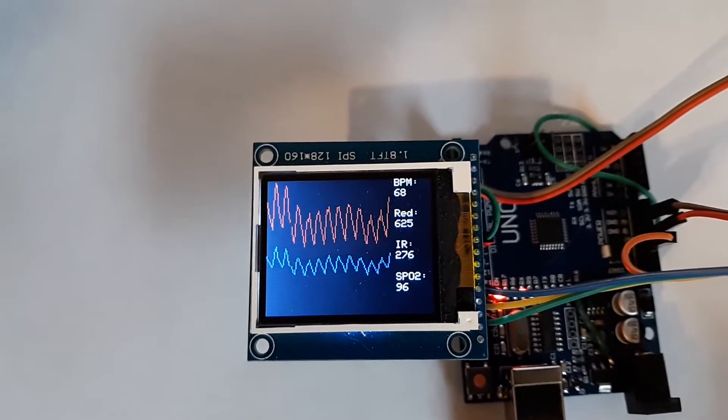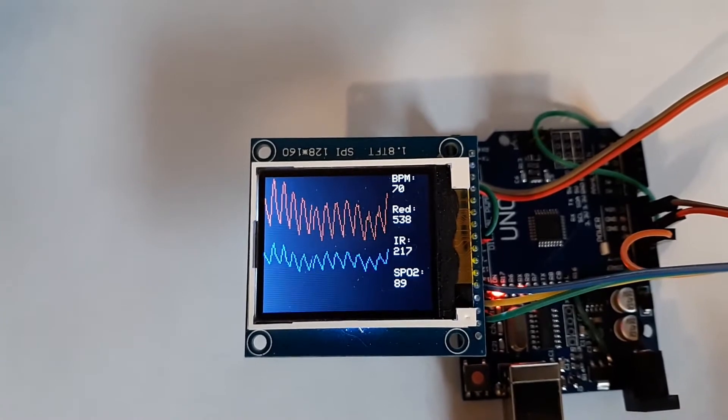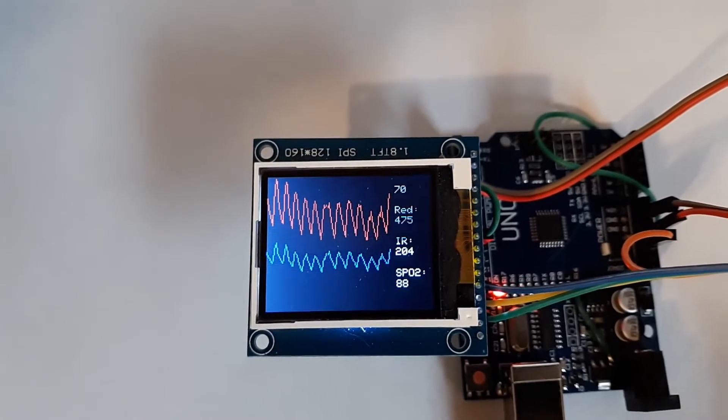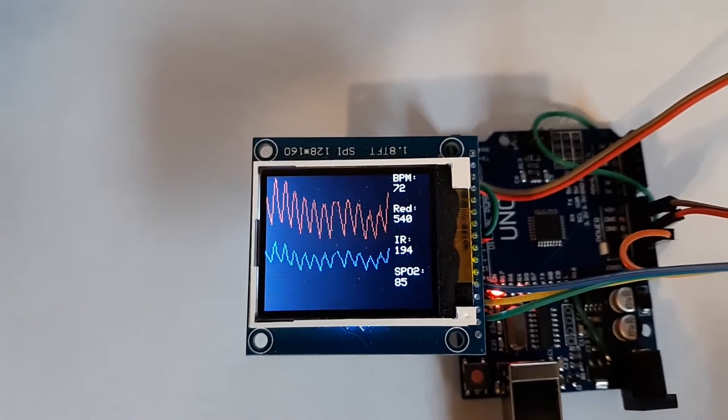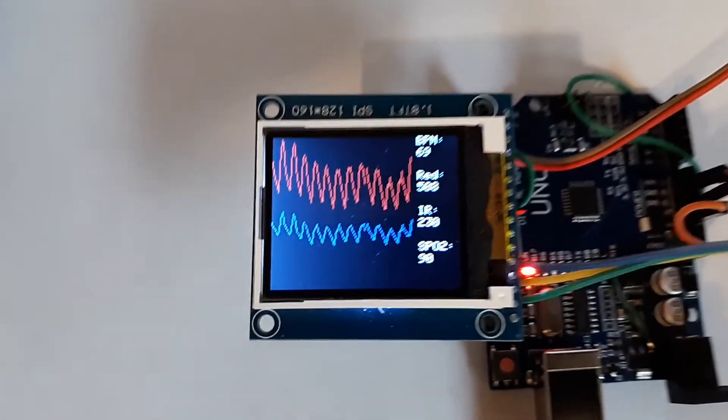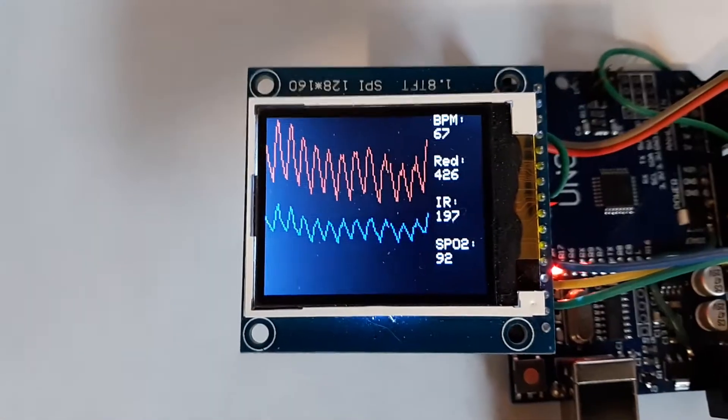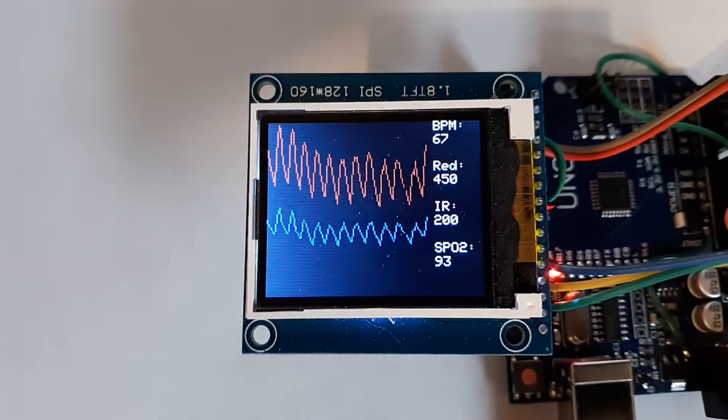I wrote my own heartbeat detection because I didn't like the one they had. And the oxygen, well yeah, I wrote my own.